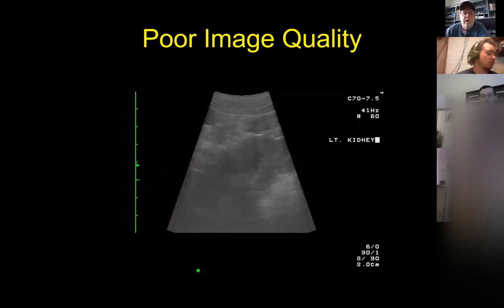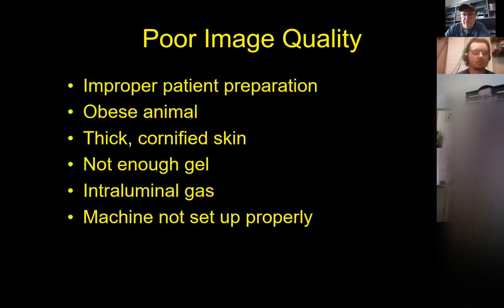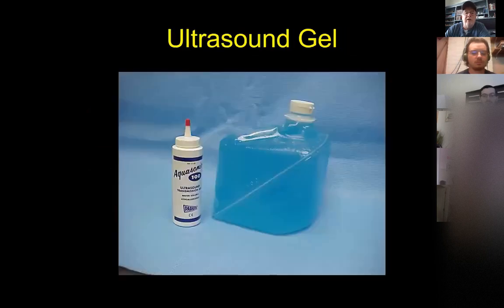So here is a crappy image, okay? In the middle here, this is part of the left kidney. But if I didn't have this here and I told you, what is that? You're gonna go, I don't know. It looks like, I can't tell what it is. It looks like there's something round or oval, but I don't know what it is. It could be a mass. In this case, it's the left kidney, and it's just a poor quality image. So then you go back to that list we just saw before and figure out, well, are any of these taking a part of this and causing this image to appear poor quality. When in doubt, again, put gel on it.